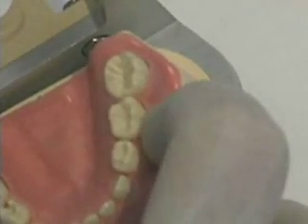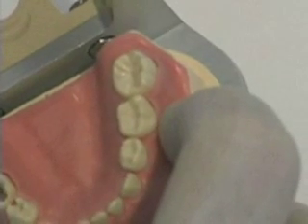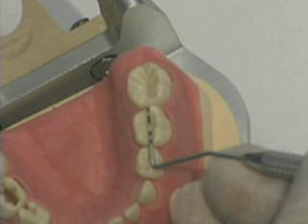Today's exercise involves the fabrication of a stainless steel crown on tooth letter K, the mandibular left second primary molar. A Boley gauge or a perioprobe can be used to measure mesiodistal dimension. Our tooth measures about 10 mm. From the stainless steel crown kit, which provides an assortment of sizes for the mandibular left second primary molars, we select an appropriate crown matching the 10 mm measurement — in our case, a size 3. In the event the tooth is grossly decayed, obtain crown dimensions from the corresponding tooth in the contralateral arch.